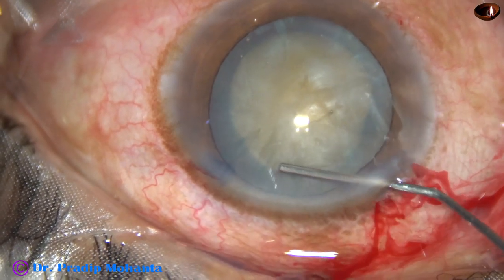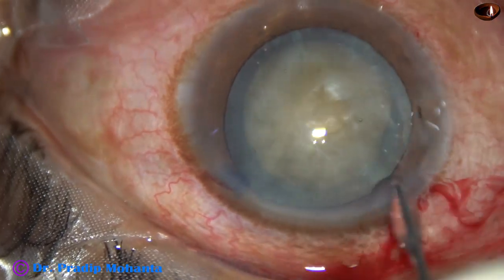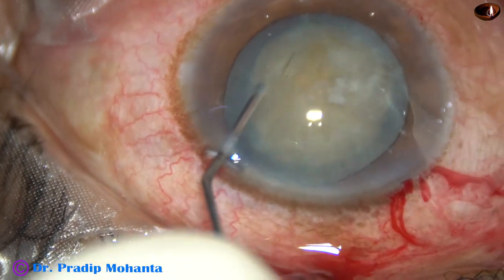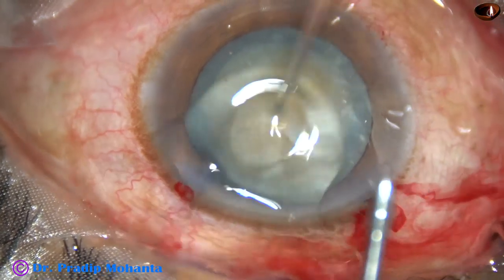Now hydrodissection is done. A little amount of fluid is injected and then the nucleus is mobilized. We can see that the nucleus rotates very nicely.